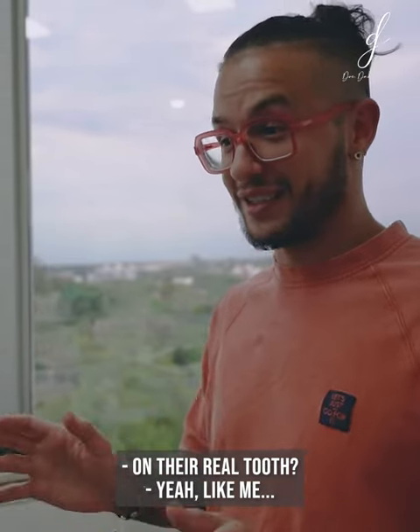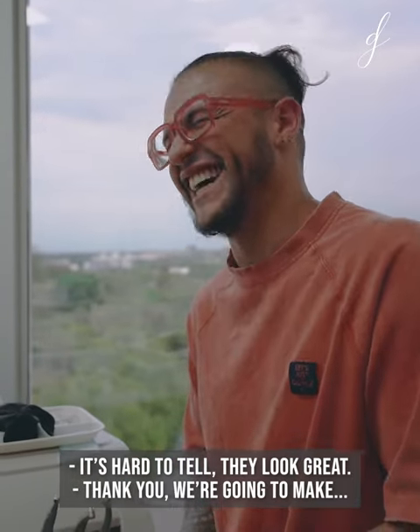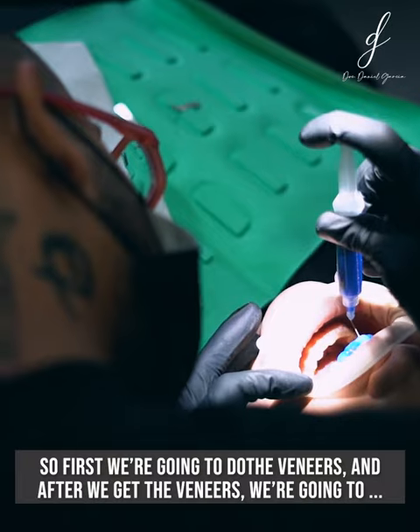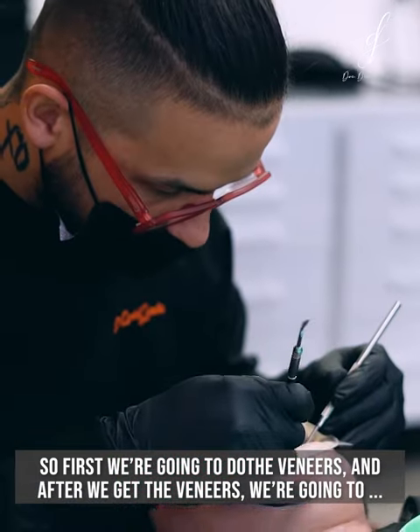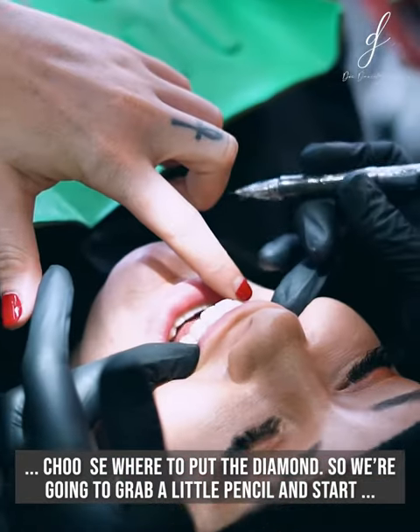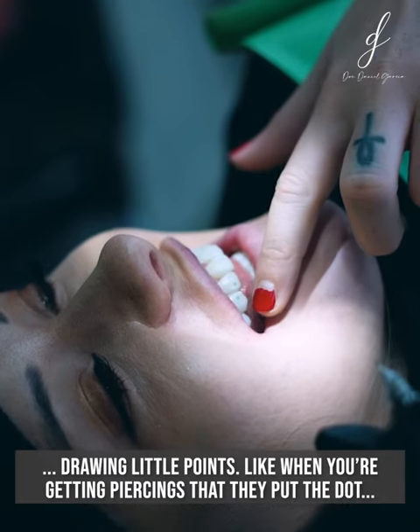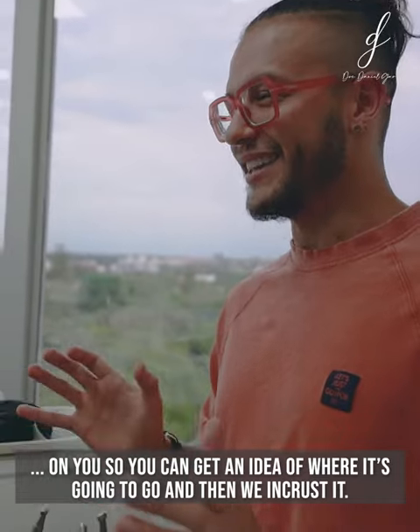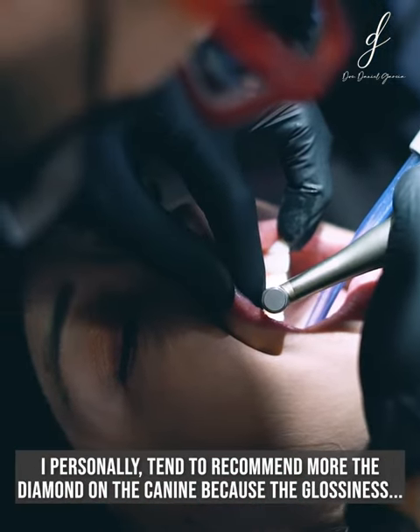On their real tooth — yeah, like yours. Your teeth are real, yeah. We're gonna make something like that for you too. First we're gonna do veneers, and after we get the veneers we're gonna choose where to put the diamond. We'll grab a little pencil and start marking little points — like when you're getting piercings and they put the dot on you — so you can get an idea of where it's gonna go.